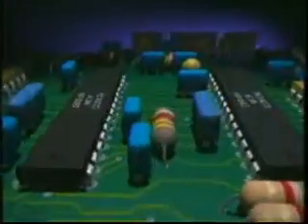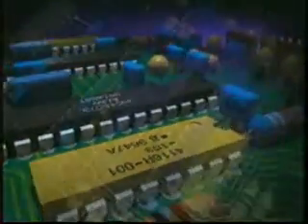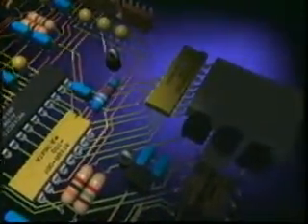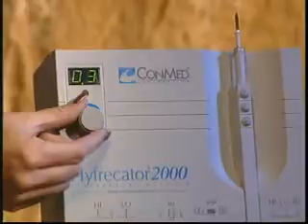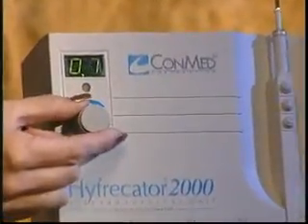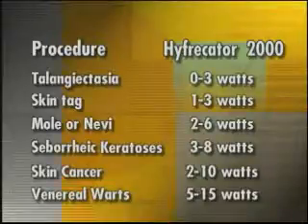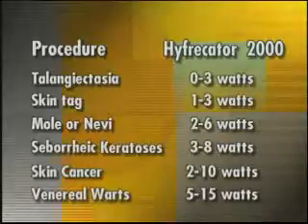The Hyfrecator 2000 presents significant advances in precise energy delivery at low power settings. The effects it delivers at very low power settings are the most precise for a device of its type. Please keep in mind that because the Hyfrecator 2000 is so precise, it may require slight power adjustments at low power settings to optimize the clinical effect. A suggested power setting chart has been included with your Hyfrecator 2000 to assist you in achieving the very best clinical results. Now you're ready to begin.